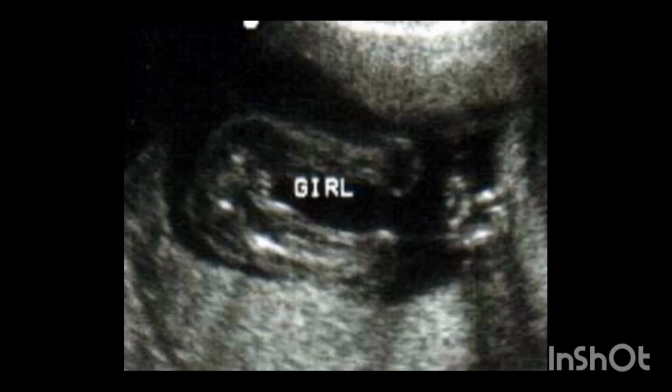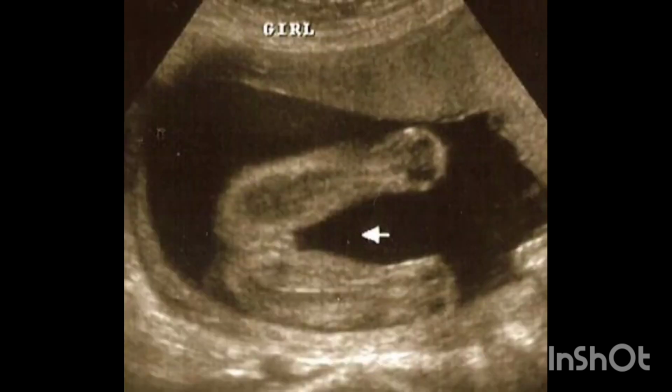Rather than the dome sign, seeing what looks like 3 light layered lines, also called the hamburger sign, in the genital area indicates a girl. Those lines are the labia majora, the clitoris and the labia minora. You will see that the labia lips look similar to a hamburger bun, while the clitoris resembles a hamburger patty.